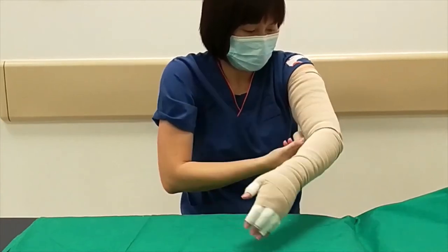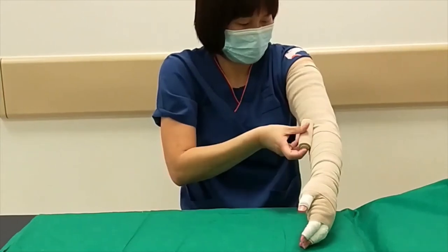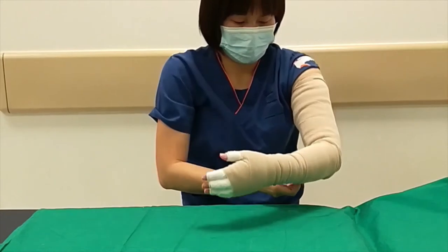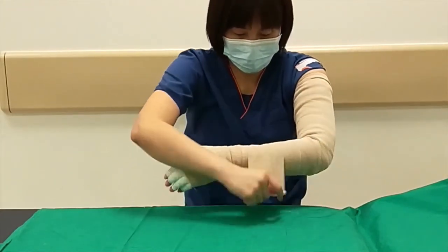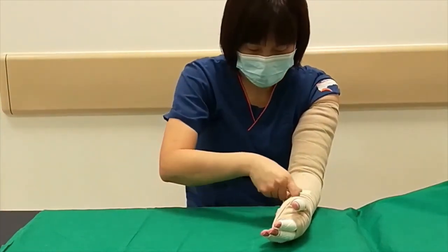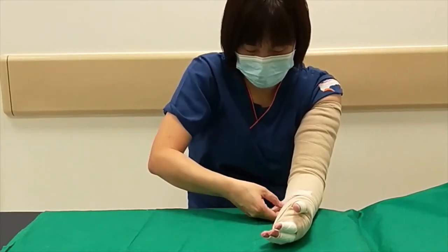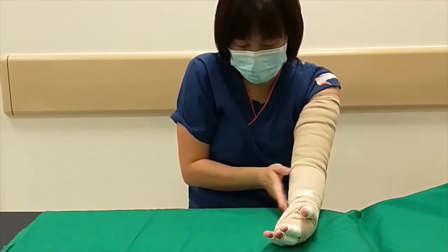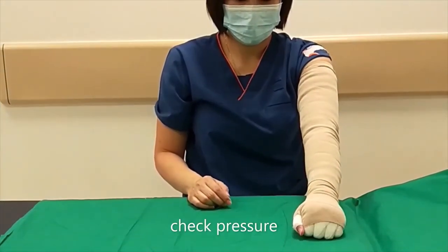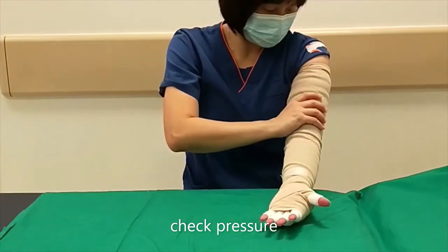As the surgery is still new, only one layer of short stretch bandage is applied. Fix the end of the bandage with tape. The junction should not be painful.